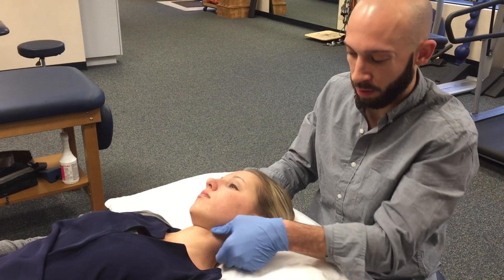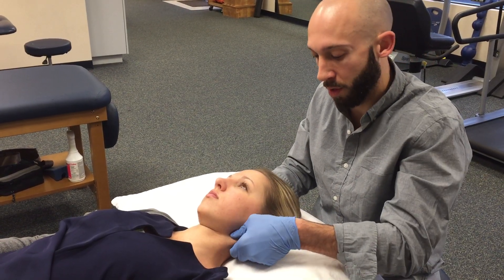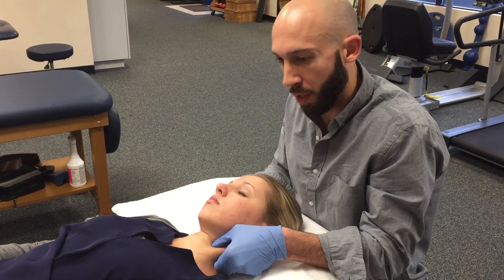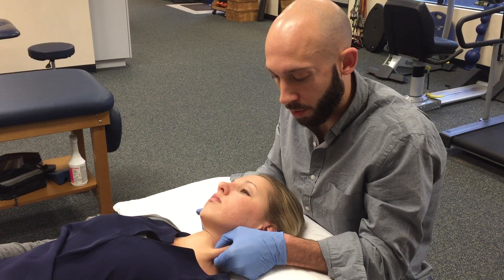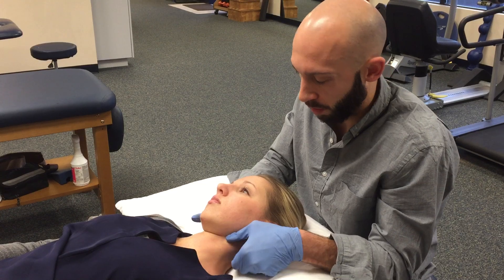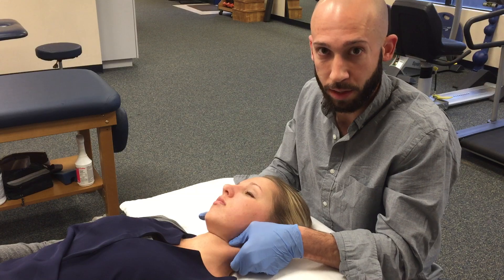Now that we have those landmarks, we're going to palpate the muscle. I'm going to use two fingers, starting up by the mastoid attachment, running along the muscle — pinching it and rolling it between my fingers. What I'm looking for is a taut band in that muscle tissue, and possibly when I roll over it you'll get a little twitch response just from that. I'm also looking at the patient to see if she's grimacing, to find any painful areas. I'll ask Laura to tell me where she feels the painful pressure point and if that pressure point refers pain to the head — that's the ideal situation.